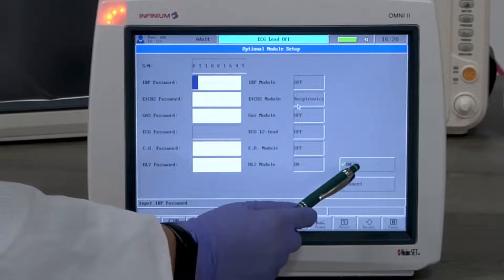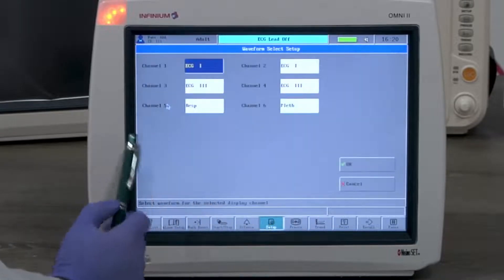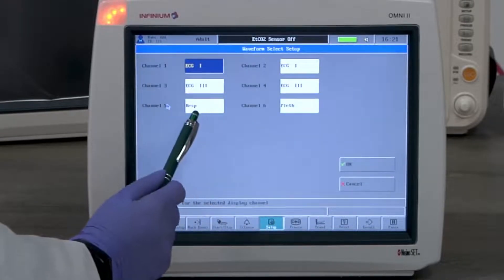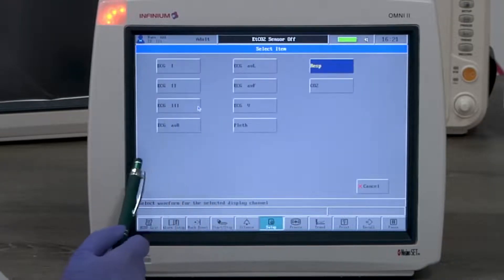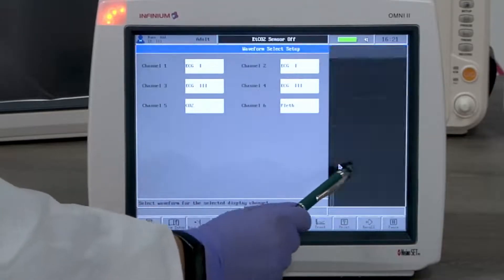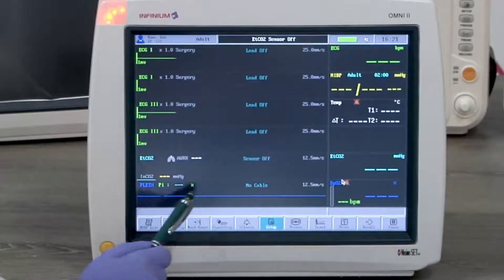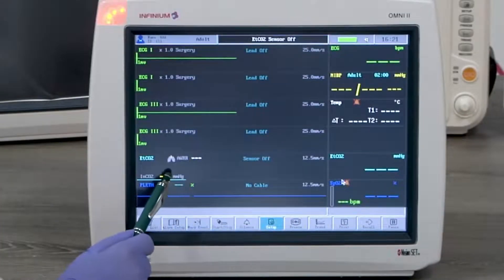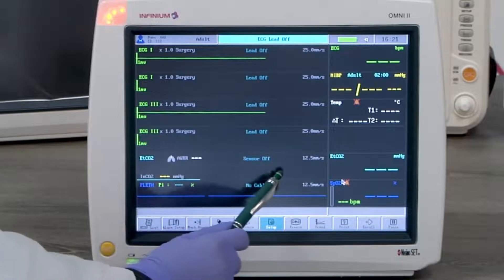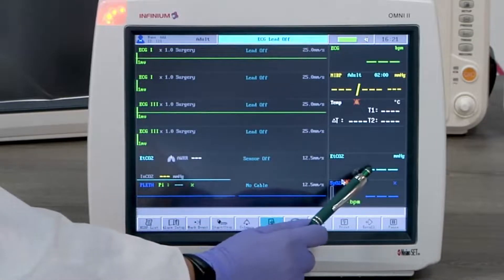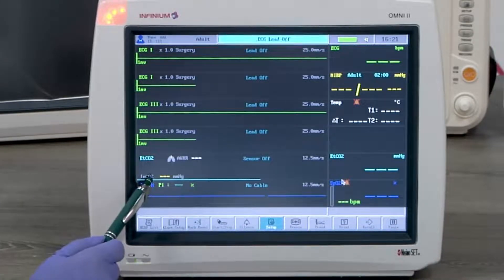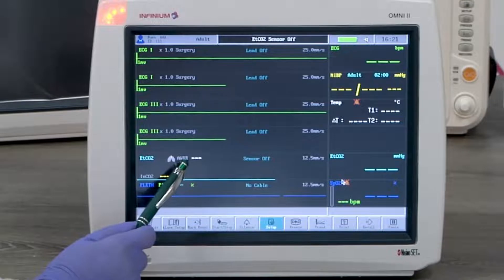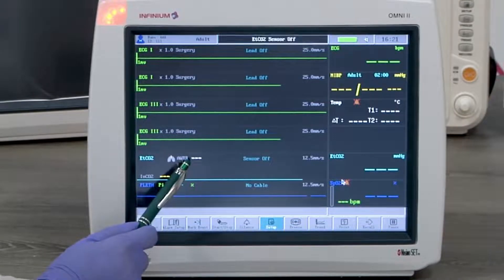To display CO2, we will replace the respiration channel as CO2. On the CO2 channel, it shows the end tidal CO2 waveform and the tidal CO2 reading, inspired CO2 reading, and airway respiratory rate.